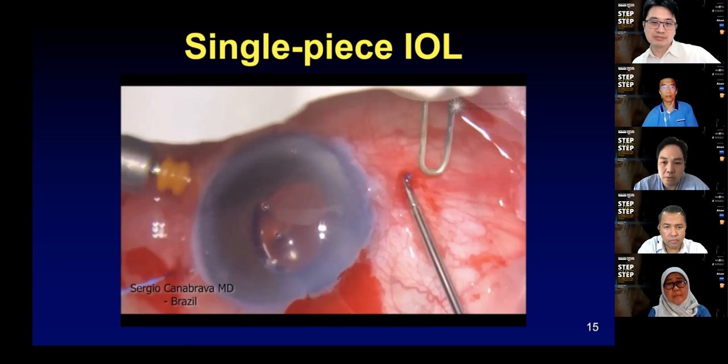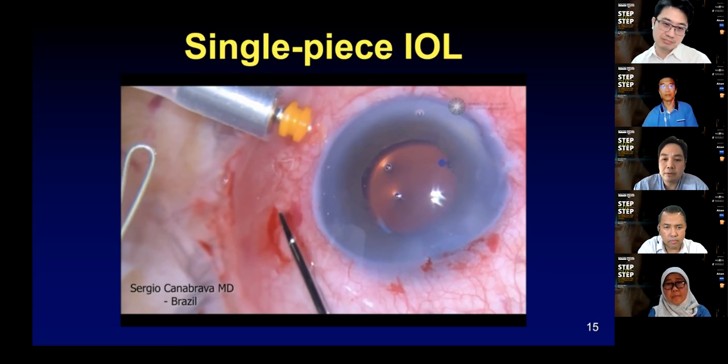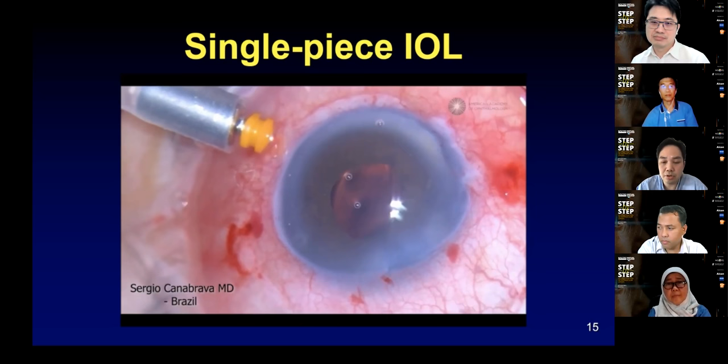And the lens sits inside pretty stable and quite central. So one of the advantages here is you don't need a flap. You don't need to tie sutures. So potentially you're using a suture, but again, getting hopefully better fixation, but quicker.